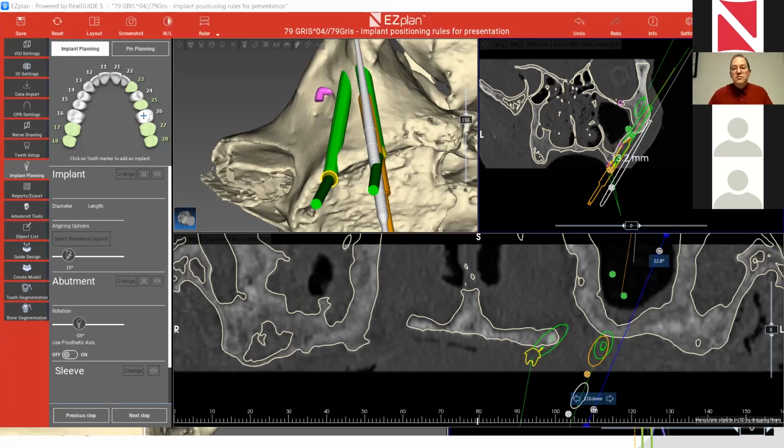But in terms of having the implant on the bone and integration with the bone, it will hold for many years. So one of the best things to do is to do this procedure guided, and then you know exactly where the implants are going to be, and you can guarantee with a lot of confidence that what you're going to do is going to be perfect. You have no surprises with guided surgery. We'll talk about this on Monday. I hope you join us.